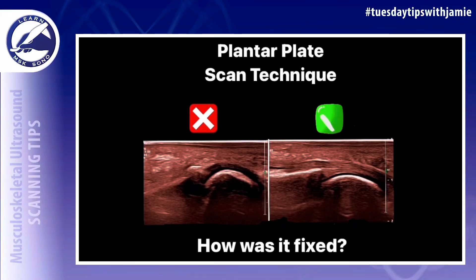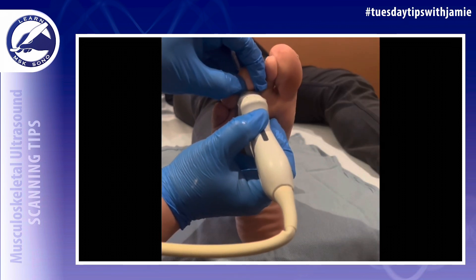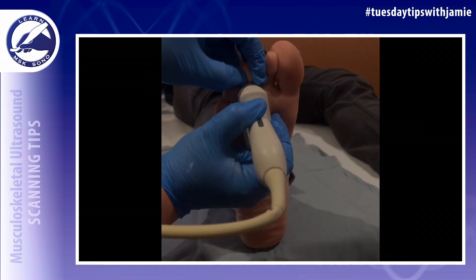Do you know the proper technique for scanning the plantar plates in the toes? It's easy to create anisotropy or mimic pathology in the plantar plates if the proper technique is not used when imaging these structures. Here are the steps that should be used for optimal imaging of the plantar plates.